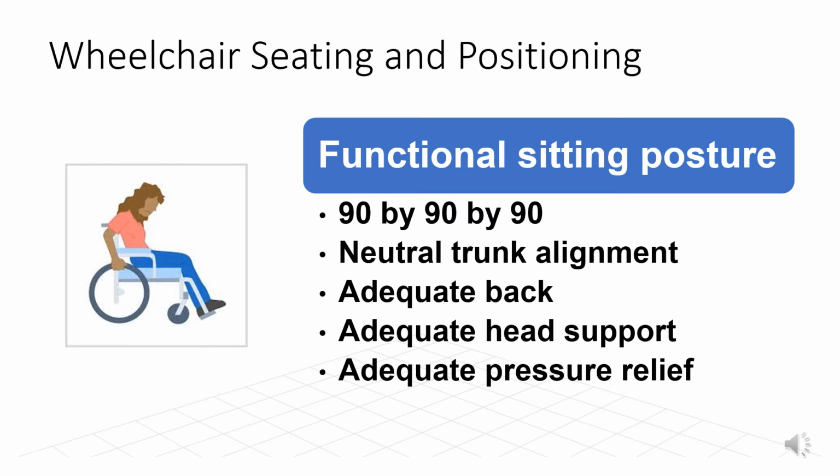And of course, neutral trunk alignment must be maintained with adequate back support, adequate head support, and adequate pressure relief.